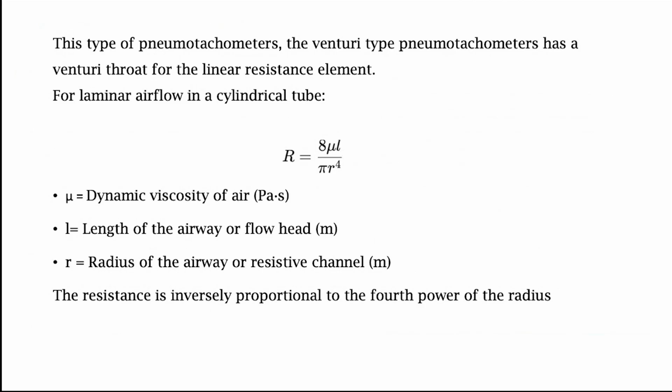And you might think that if you have small tubes, the flow inside will always be laminar, but that is not really true. There can be turbulent flow even in a relatively small tube. If the tube is too small, other things come into the picture, such as the so-called wall effects.